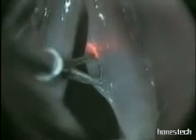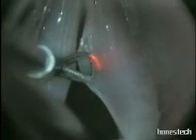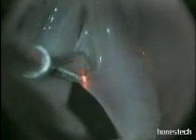A young female singer has nodules on her vocal cords. Anesthesia is by high-frequency jet ventilation. A curved beam, concave towards the left, is used for the right side. The laser settings used are 1.5 beam length, 1 mm penetration, and superpulsed wave in single pulse mode with a 350 mm focal length. The recommended power, software calculated, was 10 watts with a pulse duration of 0.05 seconds.